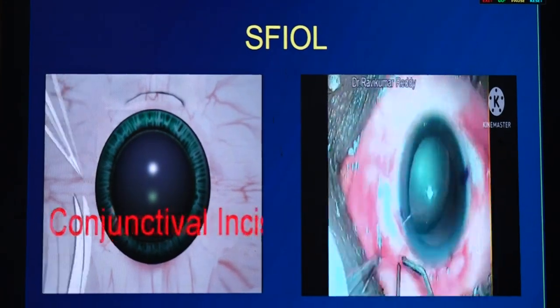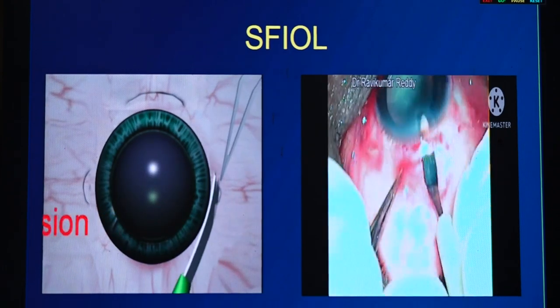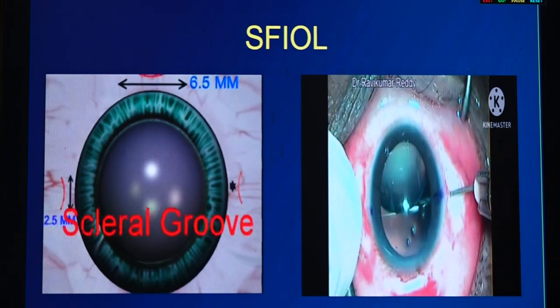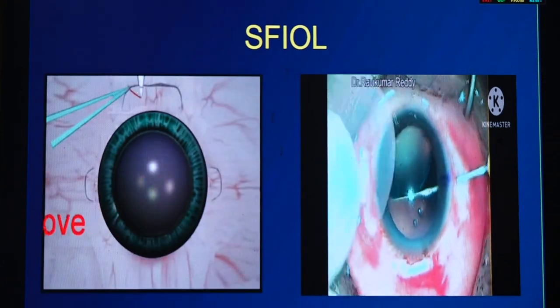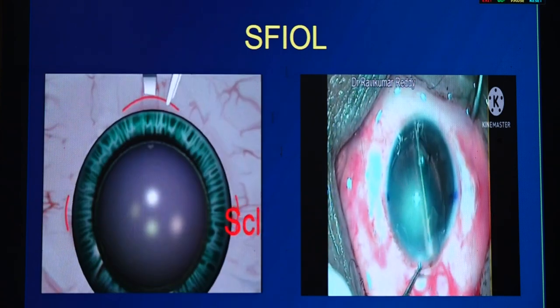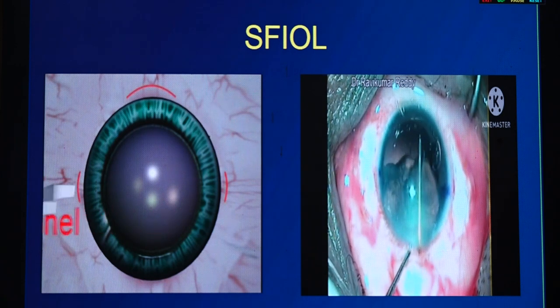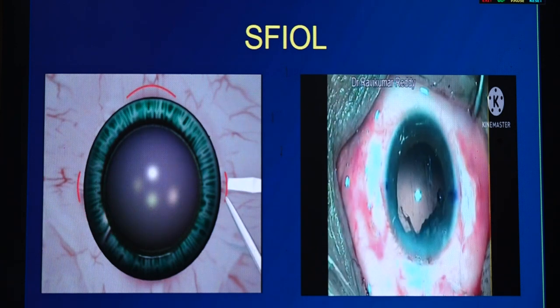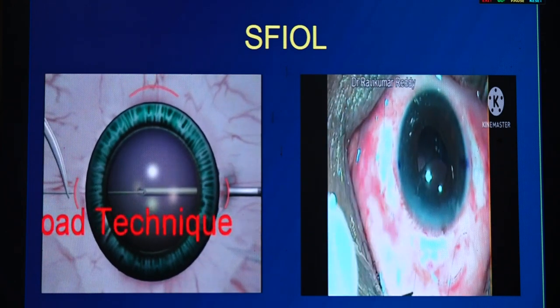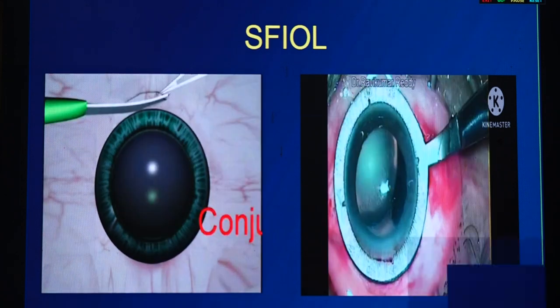So this is a case of subluxated cataract where I can do the SF lens, whereas the phaco surgeon generally refers it to a retina surgeon. So here also, the entire lens is expressed as an intracapsular lens by injecting healon, not the methyl cellulose. Inject the healon, prolapse it, and suture. The extra instrument you require is 10-0 Prolene.